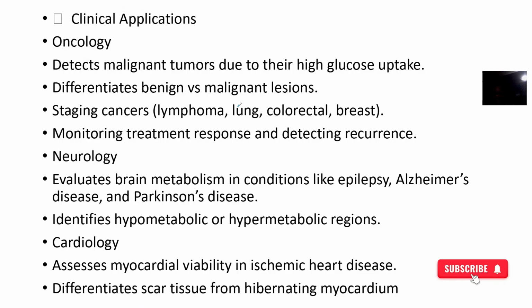So, clinical indications. It helps detect malignant tumors. You can differentiate between a benign and a malignant tumor. You can even stage cancers of lymphoma, of the lungs, of the colorectal, and of the breast. You can also use it to monitor treatment. As you are treating the patient, you want to see how it is coming along.